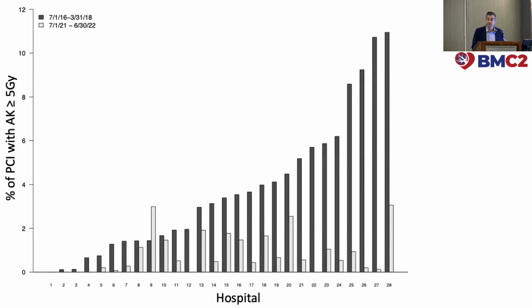Can you hear me now? Yeah. I'll just say it's the usual stuff that you taught us, in terms of frames per second and saving fluoro with the new technology. We rely on the new technology. In our lab, we have 2 labs that are old and 3 labs that are new.